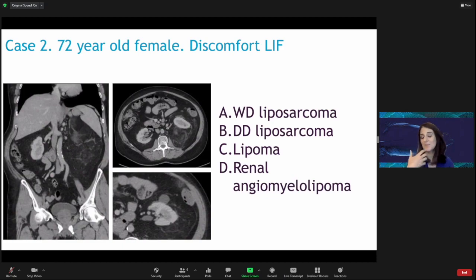And just have a go, because remember that nobody or individual people are voting. This is really just to have a bit of fun and see what most of us think. So can you spot the key feature that helps us get this one right?